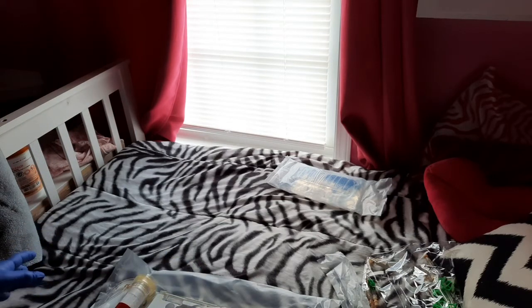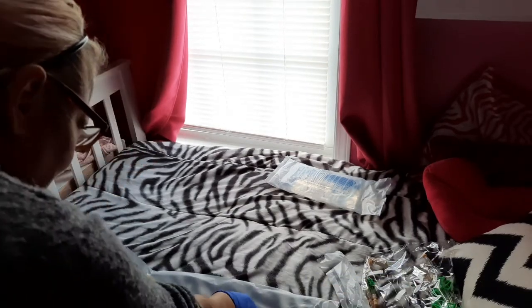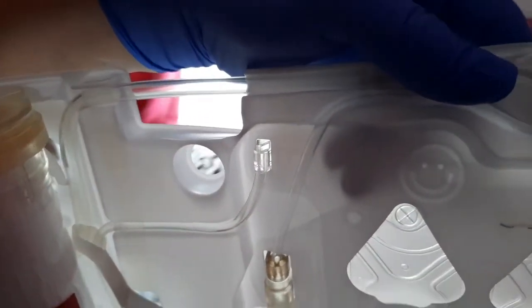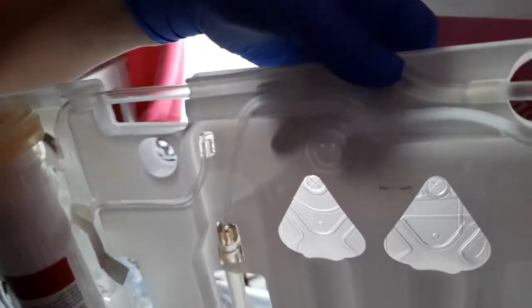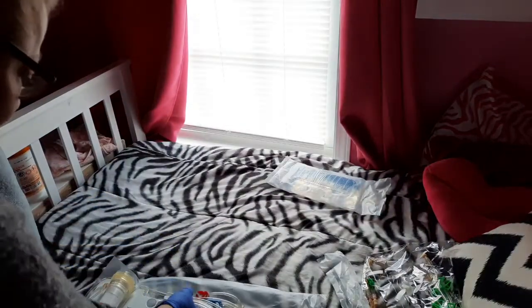Okay? Now that you've checked your seals, we're going to remove these tabs. There's four tabs. That'll free up these lines. If you're ever confused on which way things go, underneath all these lines, there's a little smiley face. I don't know if you can see that, but it's right up here where I have my thumb. There's a smiley face. You see it? That's how you know, as long as it's not upside down.